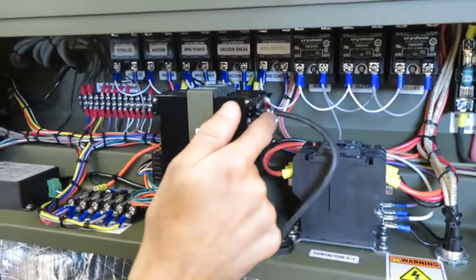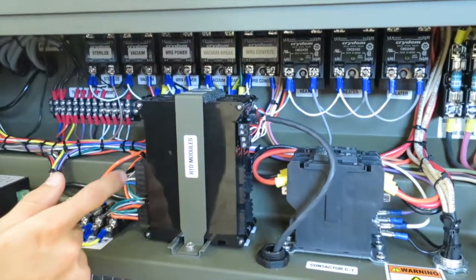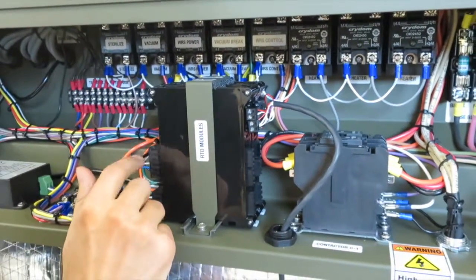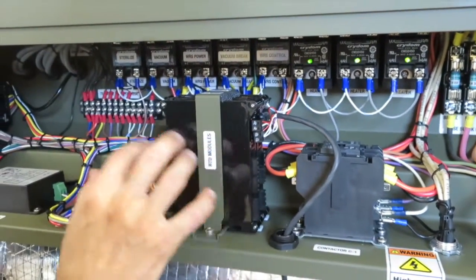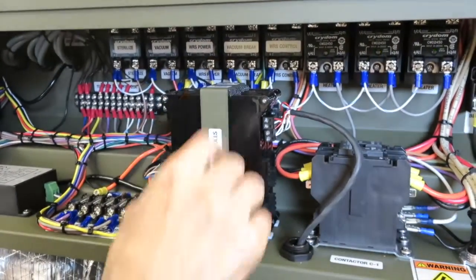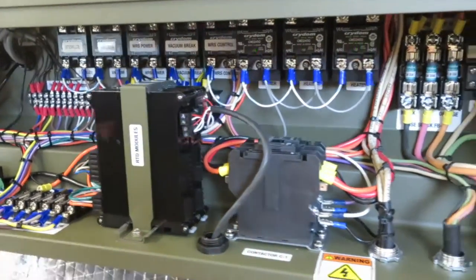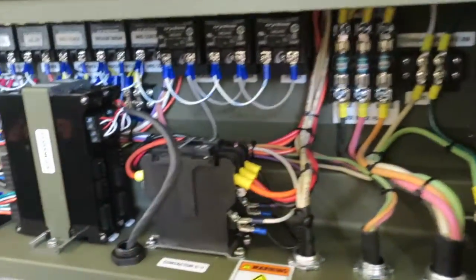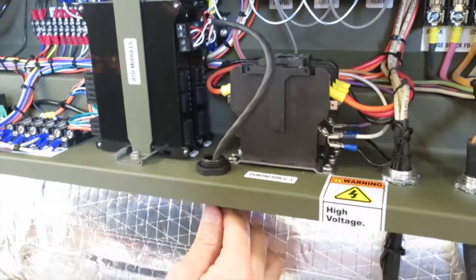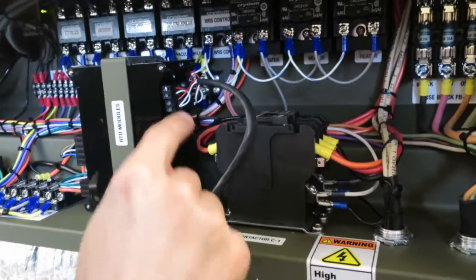These transmitters right here are very important. Here on the input side, we have an analog input coming from the RTD probes. On the output side, it's a digital Modbus output that is sent to the PLC. So these are very important for reading temperature and very easy to change out, just removing a couple screws. Very important for your temperature readings. Again, this is the cable coming from your RTD probe. You have a little cord grip here just to keep it nice and tight. So if anybody's messing with it, it won't come loose from the transmitters.